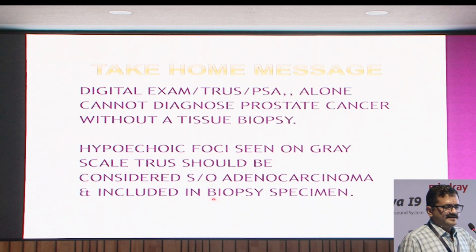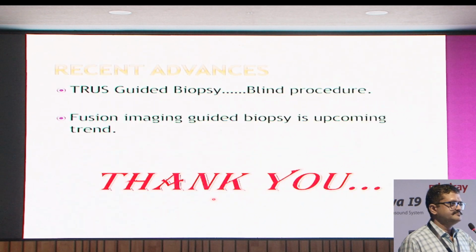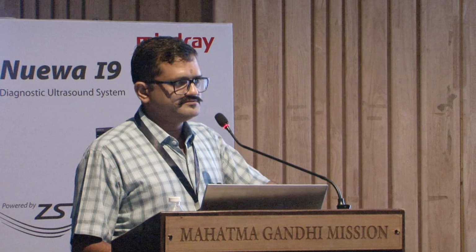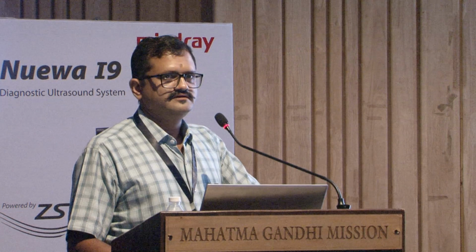Now, recent studies say TRUS guided biopsy is also a blind procedure. Fusion imaging guided biopsy is the upcoming trend. Multimodality MRI of the prostate should be done, fused with the USG, and then a precise biopsy should be done. So thank you.